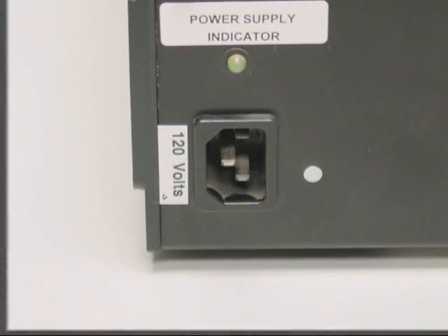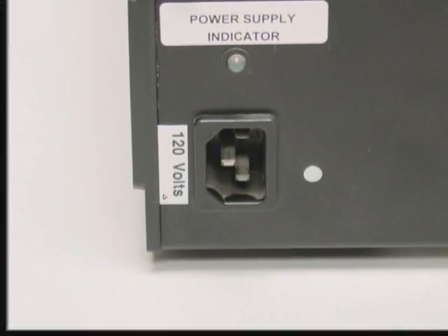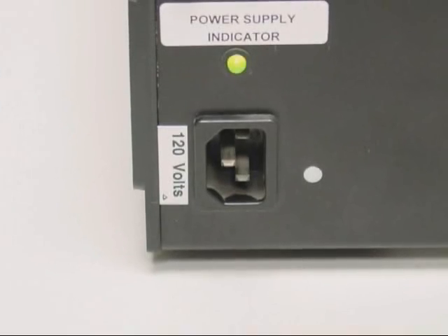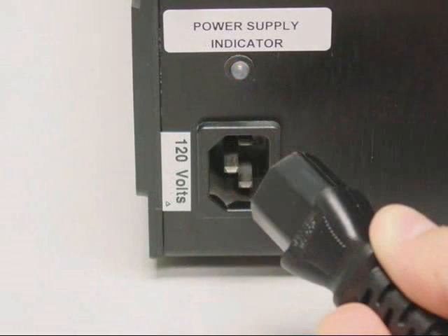The power supply indicator light will illuminate flashing green when the power timer is on and the battery charge becomes low. In this low battery condition, the reset mode is activated and the unit is inoperable. The unit must be recharged or be operated on AC power. The MS-324-AB does not charge when operating on AC power. The MS-324-AB AC line cord must be disconnected from the AC receptacle during battery-powered operation.